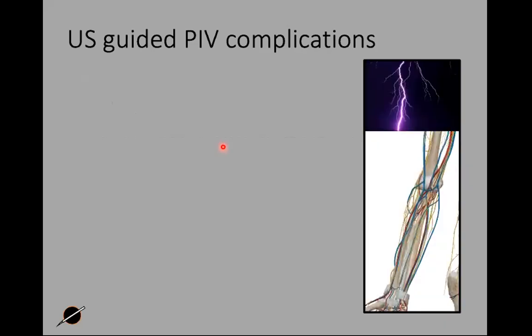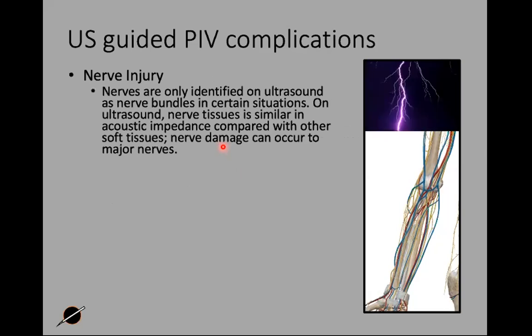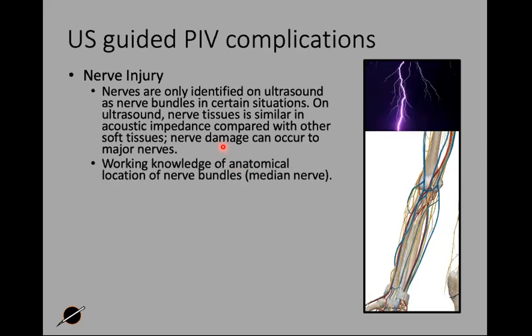Okay, what happens when we hit a nerve? Now, some people, it's happened to me actually. I went to an acupuncturist and they found that nerve, and man, that probably hurt. So when we do hit nerves, the patient will let you know that you hit a nerve. Again, we might not be able to see it, but we're going to assume based on the location on the arm and our patient's response whether we've hit a nerve.